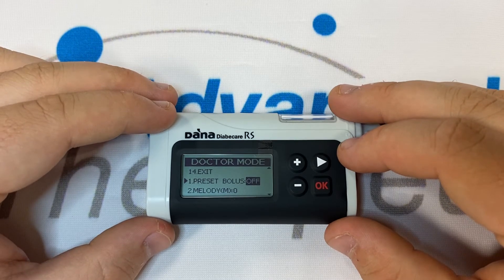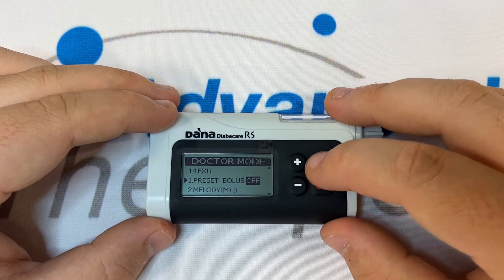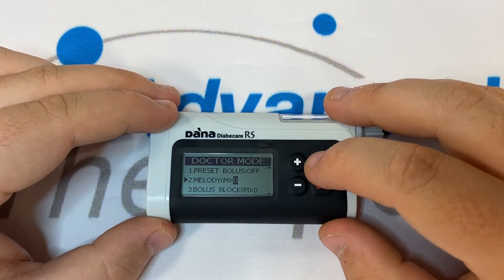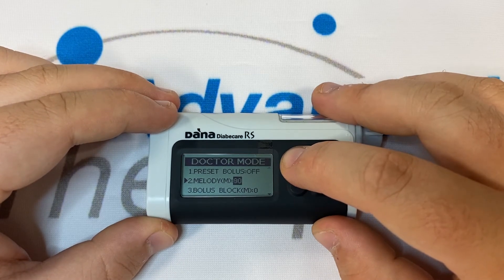Number one is Preset Bolus. You should leave Preset Bolus off if you use the bolus calculator to create your boluses as and when you need them. Number two is Melody — your check glucose alarm. By default, Melody will be set to 120.